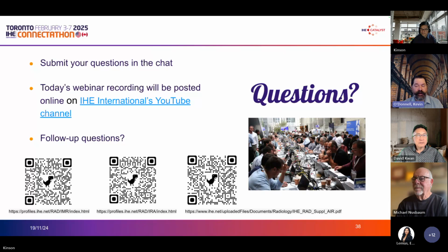The one in Trieste had a lot of focus on how you capture assessments of AI results. The radiologist says, wait, that segmentation was garbage. This detection of a pneumothorax was a good catch. The pluses and the minuses, how do we capture that information? That was the topic of one of the sessions in the Trieste Plugathon, which led to a profile this go around. So if you've got practical problems and you'd like to spend some time with your partners, the Plugathon's a wonderful place to start, doing the skunk works activities.